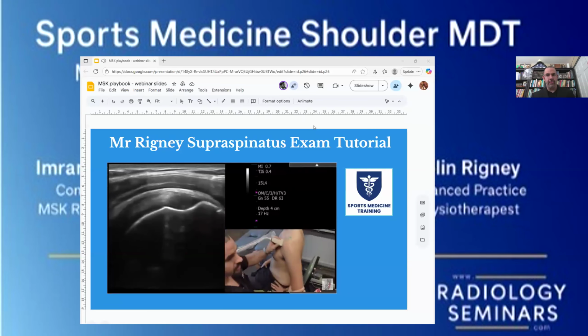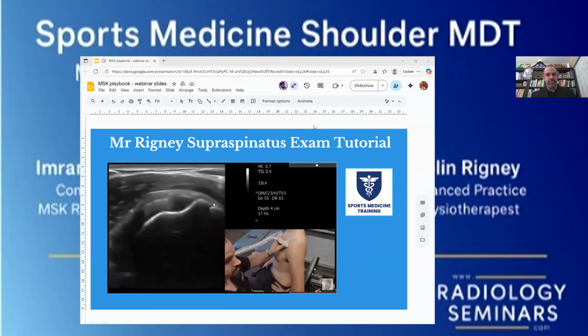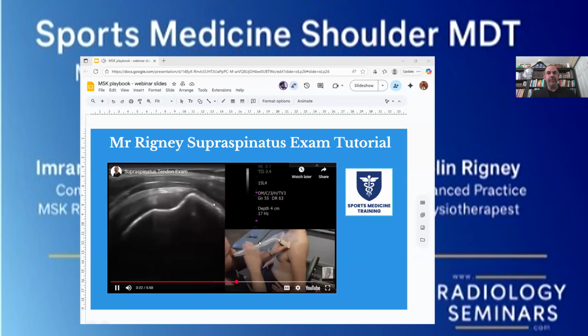What we're looking at, I'm just wagging this patient's elbow through an assisted range of motion into extension. What am I doing in extension? Well, I'm stressing the footprint of the rotator cuff. Oftentimes with big retracted tears, when you put the patient into extension, you see some tendon retraction. You see the tendon move one way and the bone move the other, what we call a paradox of movement between the tendon-bone relationship. But in a healthy shoulder, you'll see them both move at the same rate, which is what we see here.